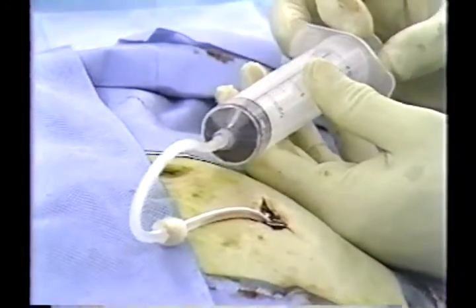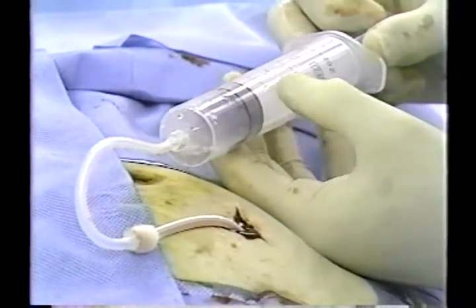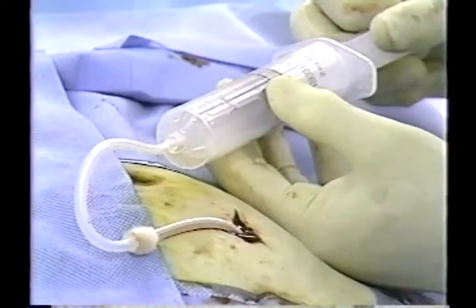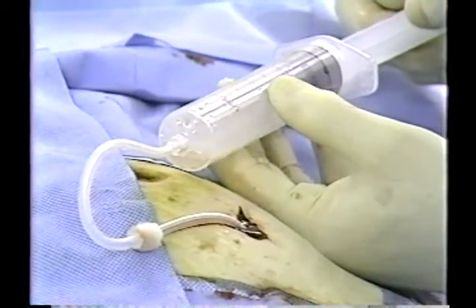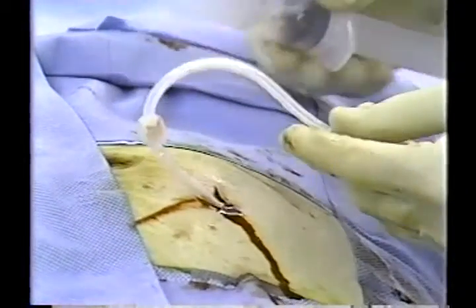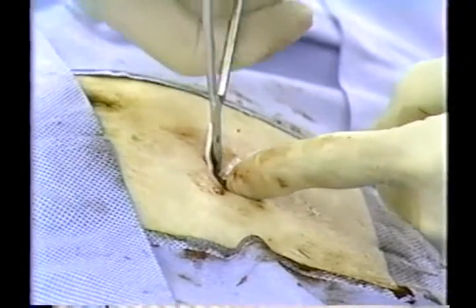The catheter is tested for patency, and air or fluid may return in the syringe. This may be done several times to eliminate much of the air entrapped in the peritoneal cavity. With a hemostat, the deep cuff is now seated into the rectus sheath.